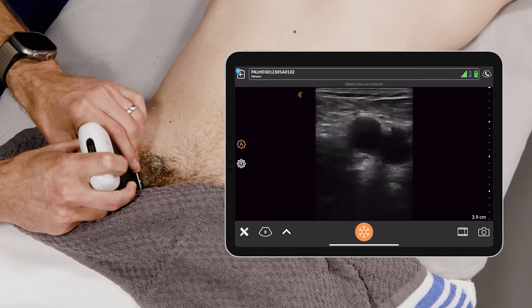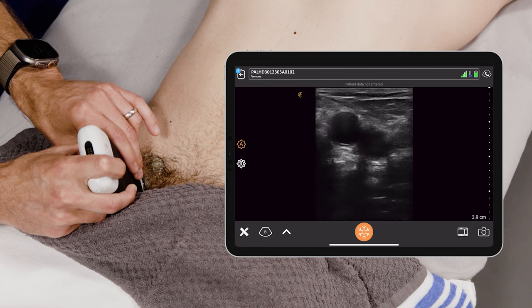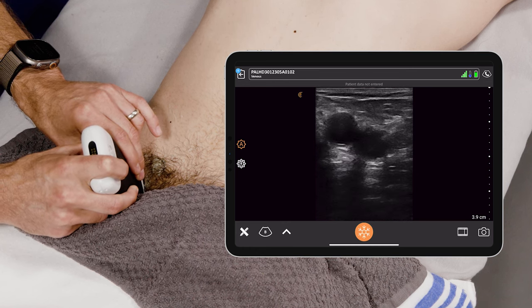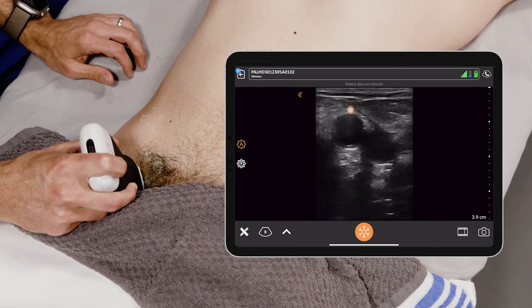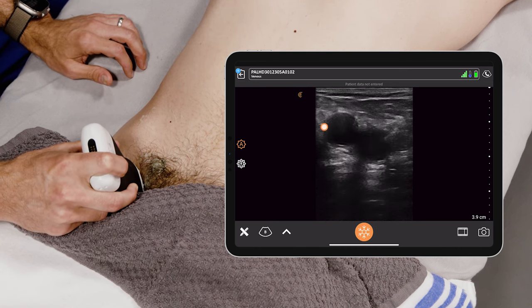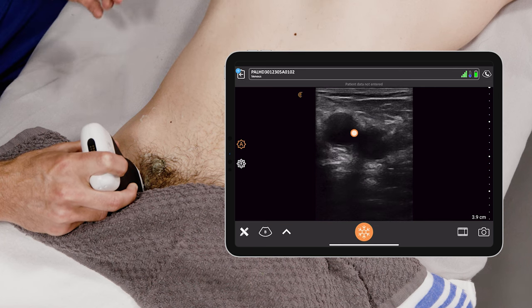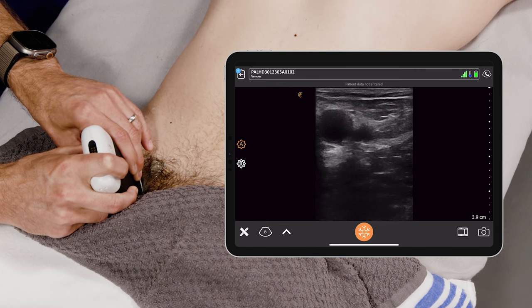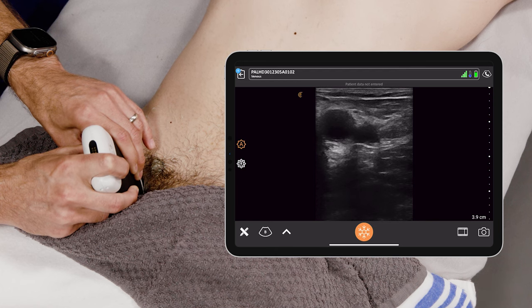In this ultrasound view, we're using a venous setting because we're going to do a venous central line. What you immediately see are two structures. The more anterior structure that's somewhat pulsatile is our artery, and what sits a little deeper and medial is the femoral vein. If there's any question, you can compress down and see that the femoral vein is easily compressible, while the femoral artery is still pulsatile and non-compressible.